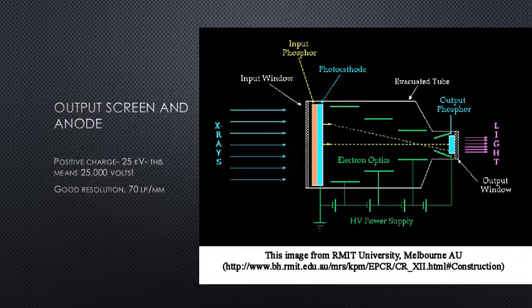The phosphor at the output screen is different than the input phosphor screen, and it's called zinc cadmium sulfide. This layer is very thin and small, and that helps to provide better resolution. A small layer is then applied as a filter that prevents any isotropic light emission from hitting back on the screen and degrading the image. Fiber optics are used at the output screen to gather the light in more modern systems.